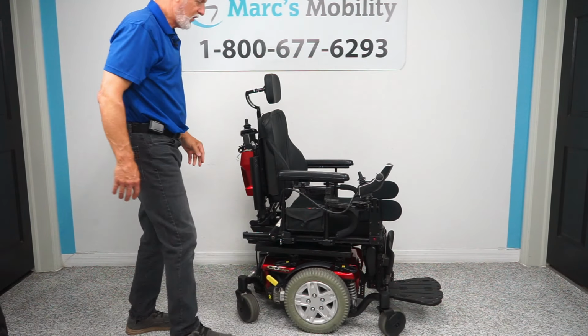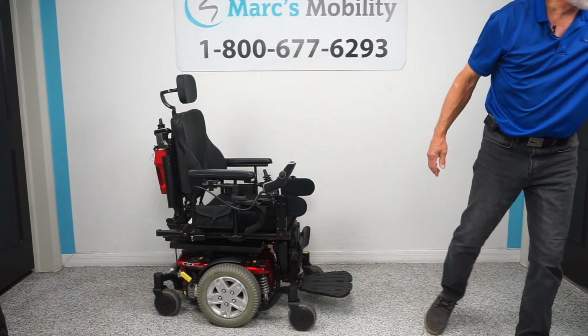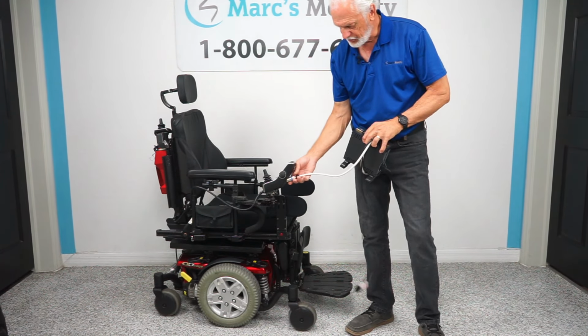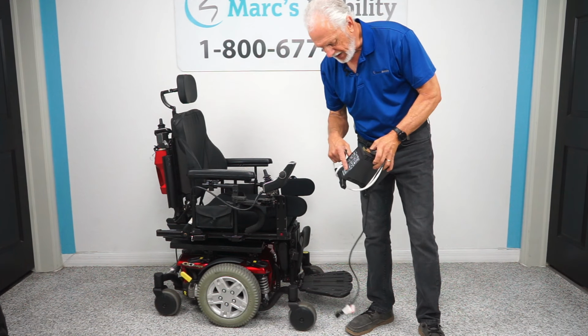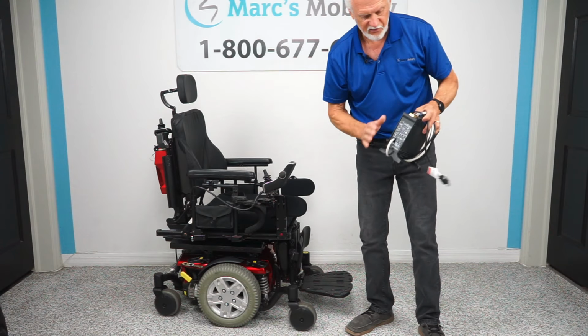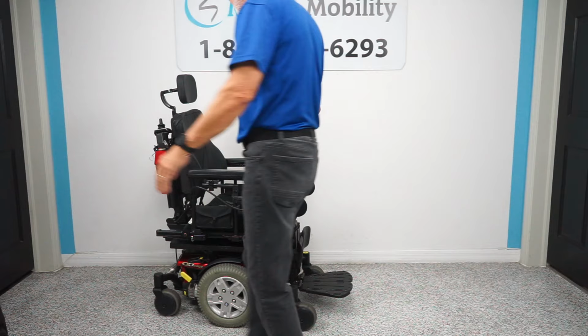Okay, I think we've covered everything. So when you charge the batteries in this chair, you'll take your Quantum charger and you'll plug it right here under the joystick. And as soon as the light goes from orange to green, the charger will stop charging. These are smart chargers. They know when to stop charging. They're not going to overcharge your chair.